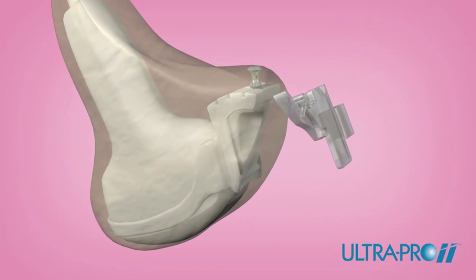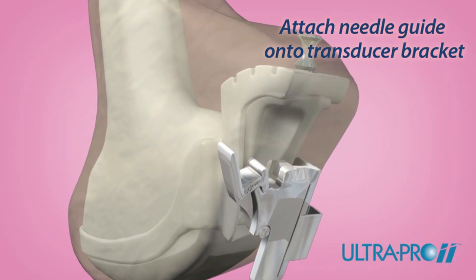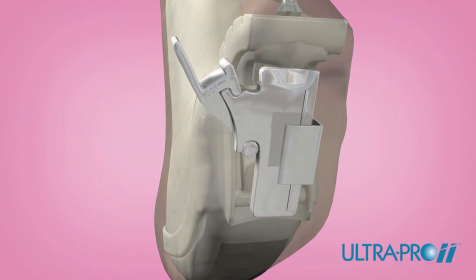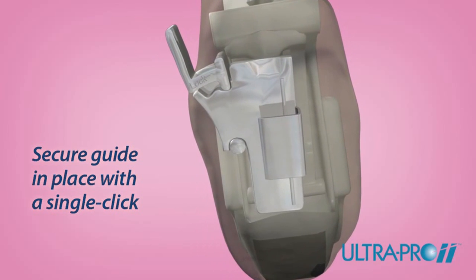Slide the disposable UltraPro 2 needle guide onto the transducer bracket. The UltraPro 2 needle guide features a robust lock for secure attachment to the bracket. Using your thumb, lock the UltraPro 2 needle guide into place by pressing the locking mechanism inward.